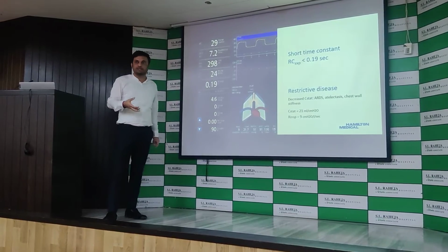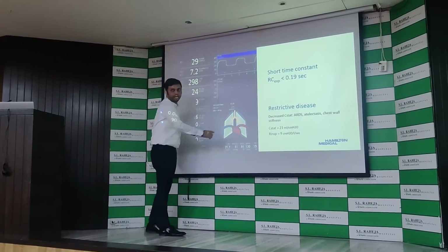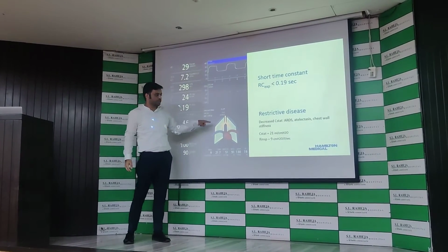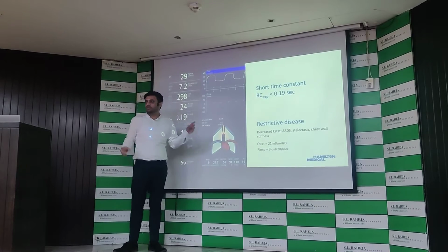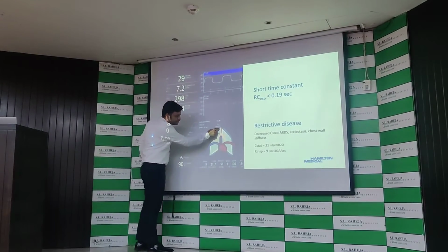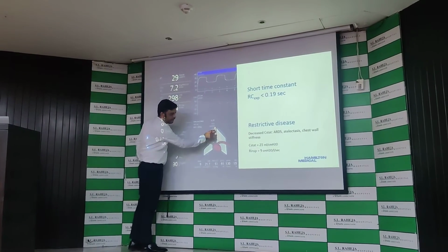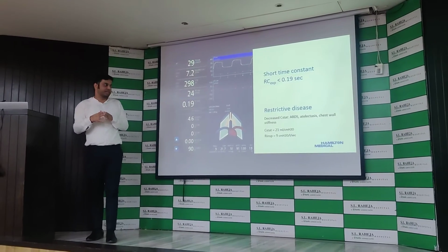So when the patient takes the inspiratory effort, we'll be able to see the diaphragm coming in, blinking. Similarly, for any sort of obstruction, you will see red marking lines inside, which shows that there is an increased resistance. And if you see, this is a normal lung volume, and the actual lung is a little closer, less.